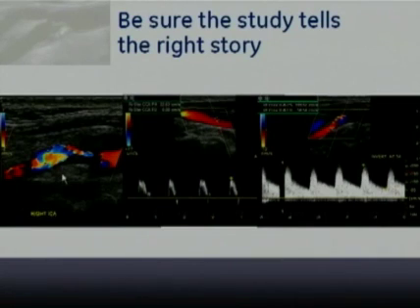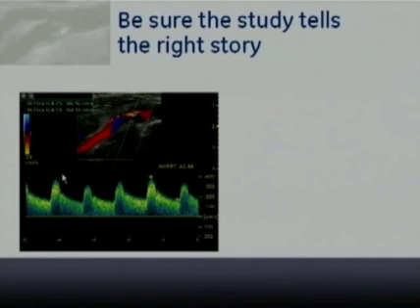So we brought the patient back down to look again, and as suspected, when we looked at the highest velocity in the internal carotid artery, it's actually closer to 400 centimeters per second rather than 200, so nearly doubled. And part of that had to do with the sampling location. She had not walked the Doppler through the entire area. She was sampling actually just distal to the area of maximum stenosis.